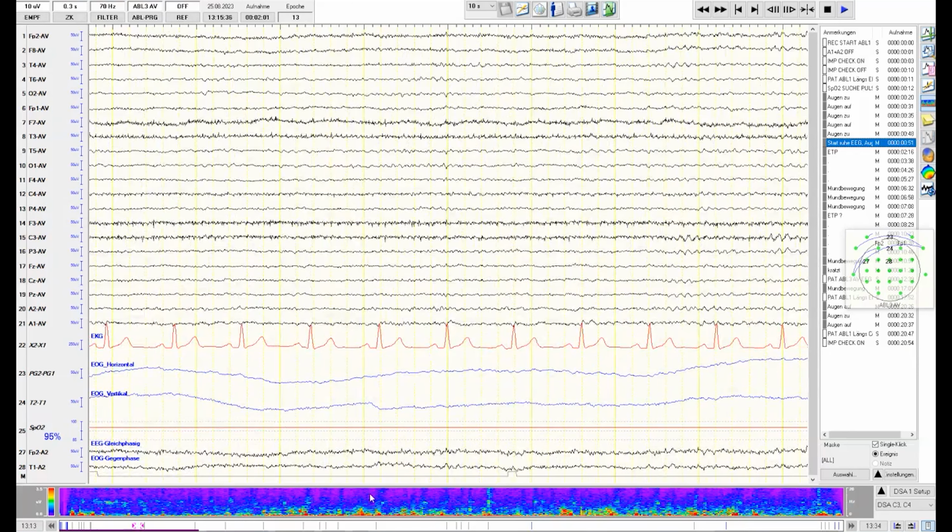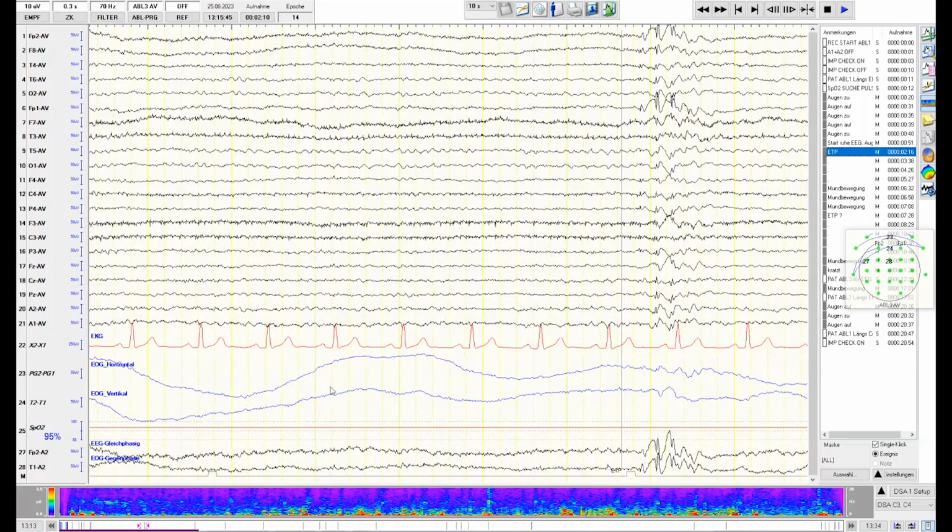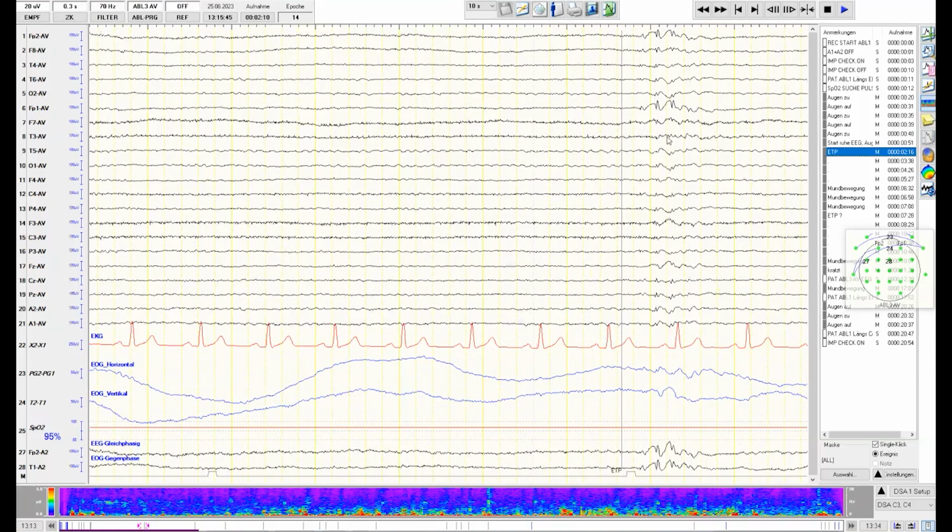However, this is not the only thing we need to look for. We also look for epilepsy typical potentials, and we screen for that. And this is what first occurs here. So this is where the technician, also very aware, made the first mark. And what we see over here, I make it smaller in amplitude, we see clear spikes with also a spike wave configuration. So these small things are marked for you.